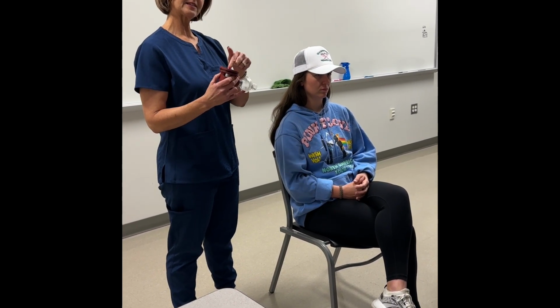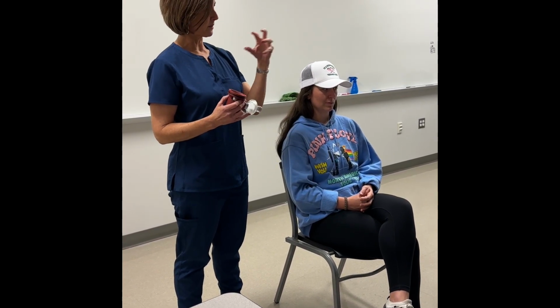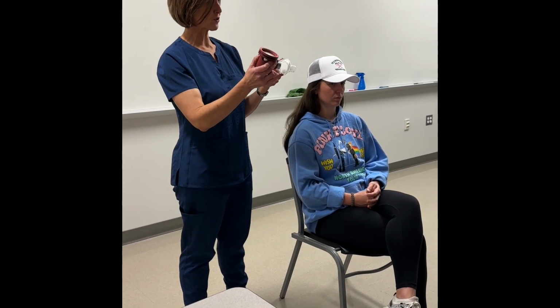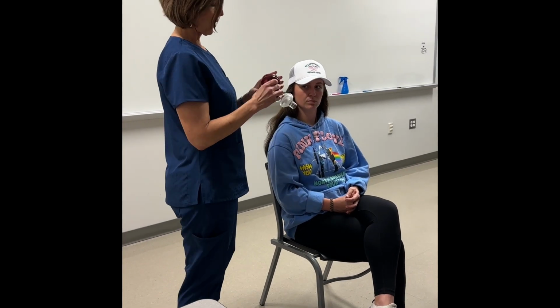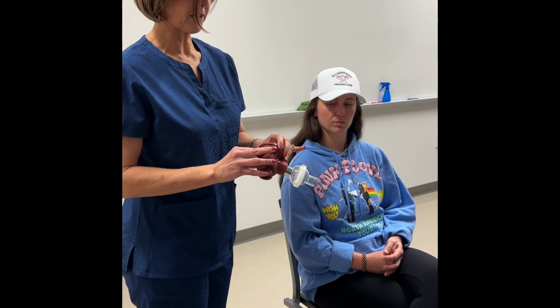At the same time this is measuring, you're gonna count the respiratory rate. And at the end, we're gonna do the minute volume formula and solve for tidal volume. So by measuring for a minute, we're gonna get the minute volume, the respiratory rate, and calculate the tidal volume. Does that make sense? Okay, so we're gonna turn this on so it starts measuring.